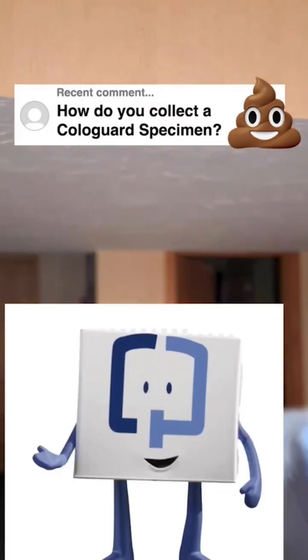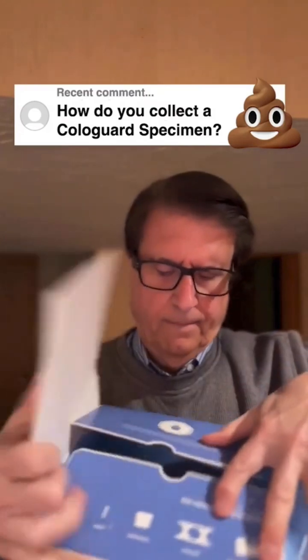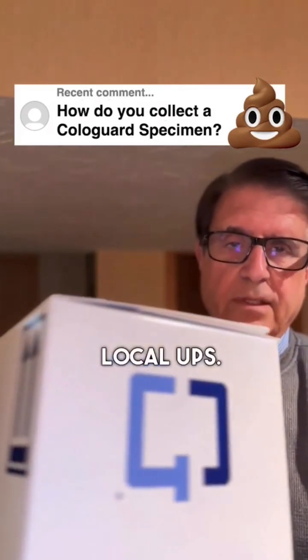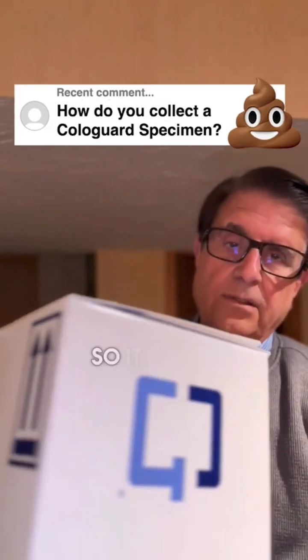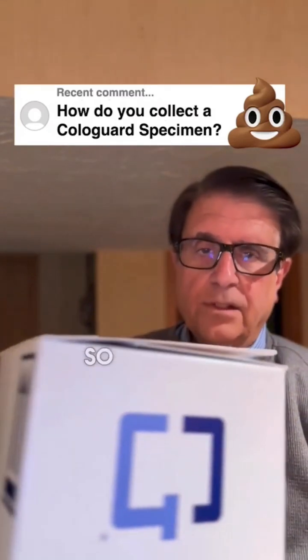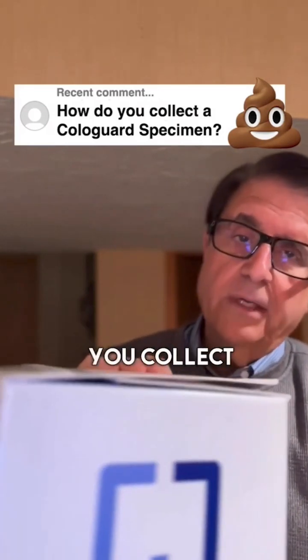Then you put it back in this box, in this plastic bag, and it seals up. You take the box to your local UPS, and the postage I believe is free — it's a $600 test, so it should give you free postage. You mail the Cologuard back to the Cologuard company, and then they test it whether it's positive or negative. So basically, you poop in a little bottle or bucket and you mail your poop back to the company. And that's how you collect the Cologuard specimen.